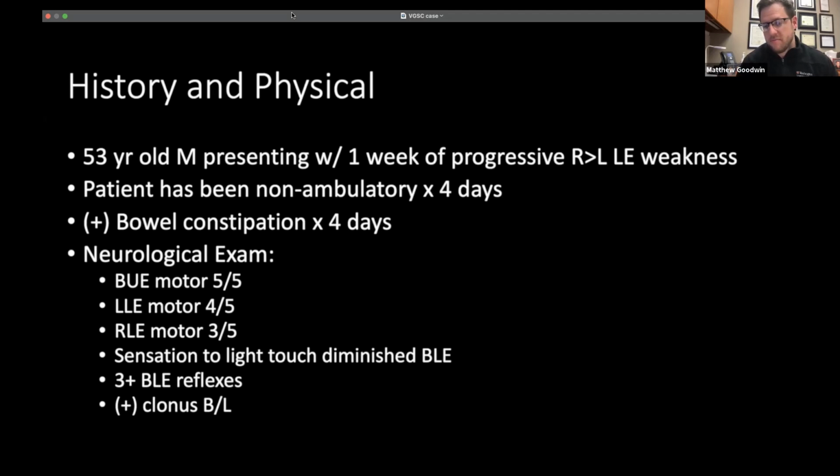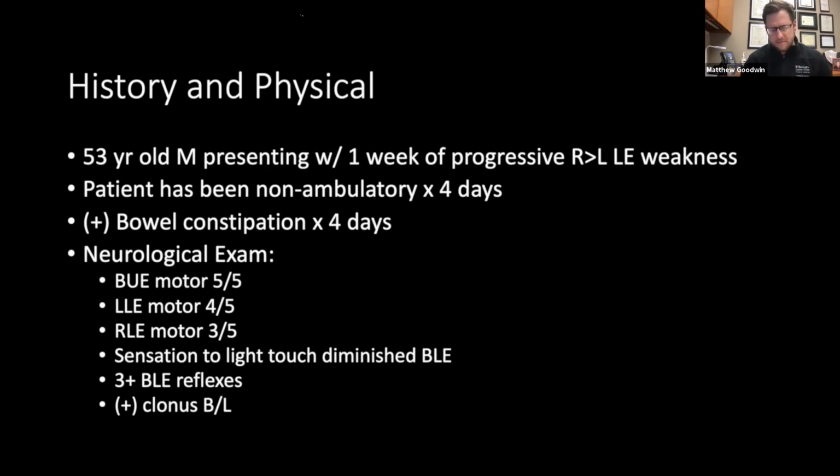And you're right. We weren't on the Pro-Axis table, right? We were on a regular table. I really wasn't anticipating that. So I think I might have considered a little more what my construct was, because I think I had her a little better on the table, but spanning that side with no bone, with one titanium rod and one screw distal. I'm not a cross-link guy for a variety of reasons that a lot of us aren't cross-link people, but that construct probably wasn't perfect either, right? So that was probably a little weaker than it should have been. So I would have beefed up the construct, maybe used the Pro-Axis, maybe considered going to the pelvis.